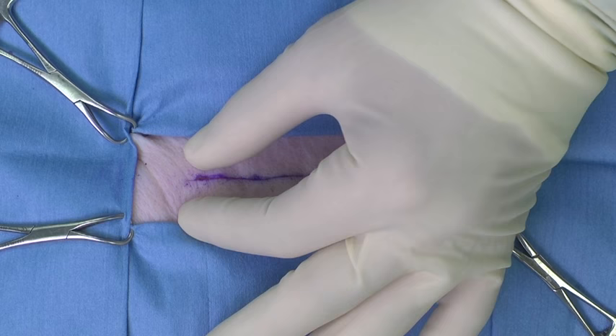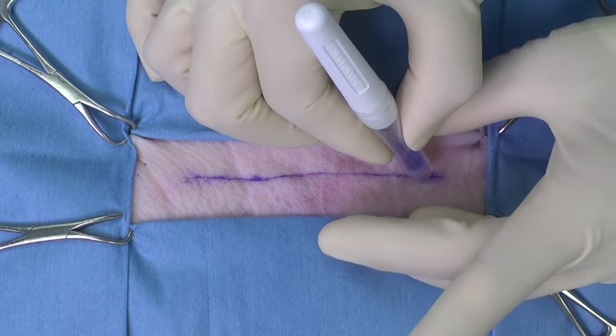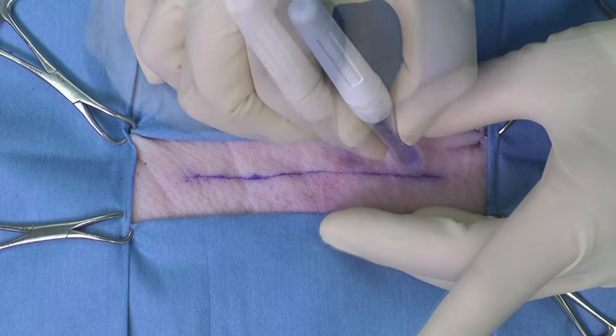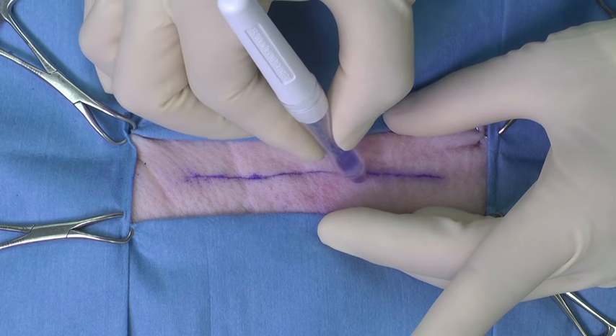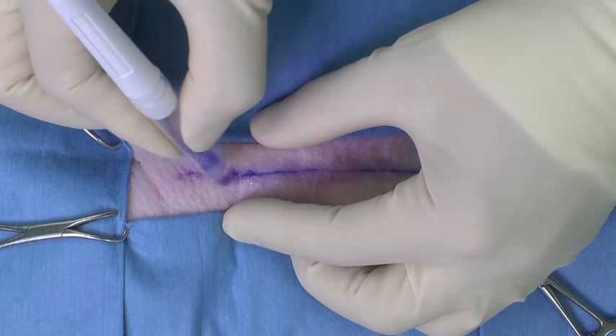Approximate the skin edges with sterile gloved fingers or forceps. Apply the liquid adhesive slowly in one continuous layer to the surface of the approximated skin edges using a gentle brushing motion while maintaining constant applicator bulb pressure.